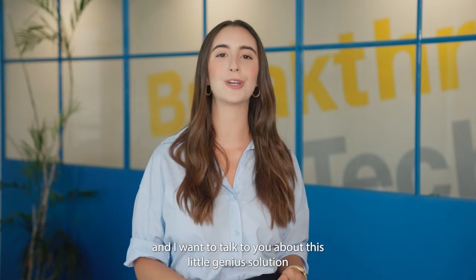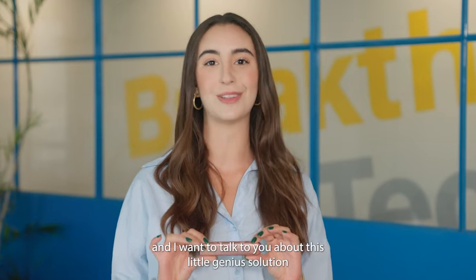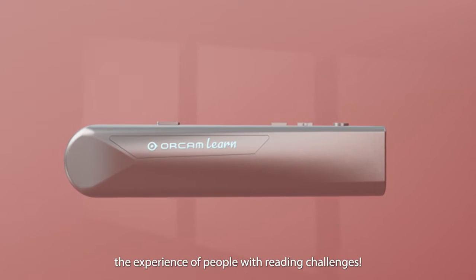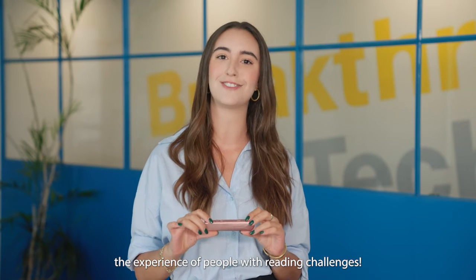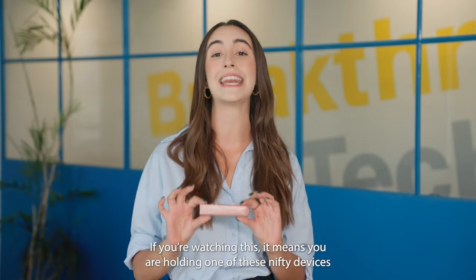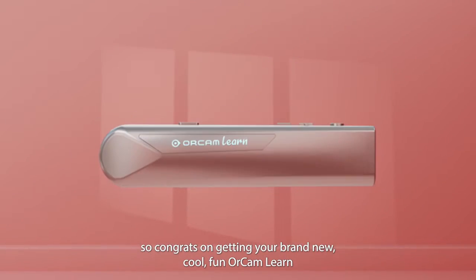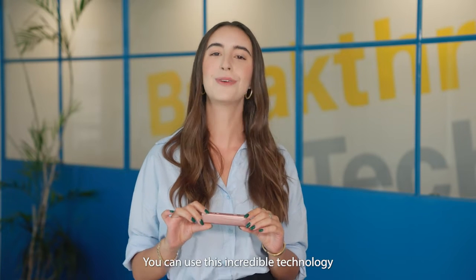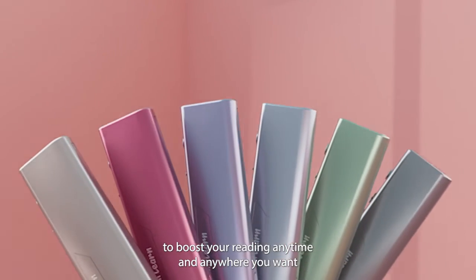Hi, I'm Emmanuelle from OrCam Technologies and I want to talk to you about this little genius solution we've pioneered that's going to completely revolutionize the experience of people with reading challenges. If you're watching this, it means you're holding one of these nifty devices, so congrats on getting your brand new OrCam Learn. You can use this incredible technology to boost your reading anytime, anywhere that you want.